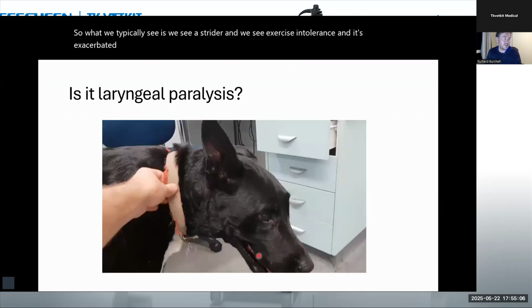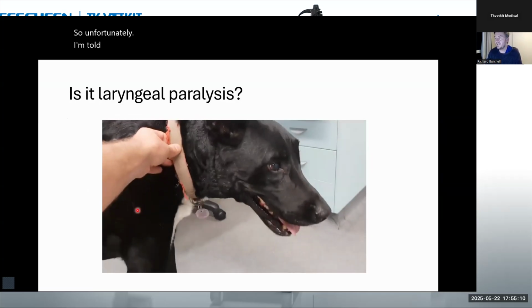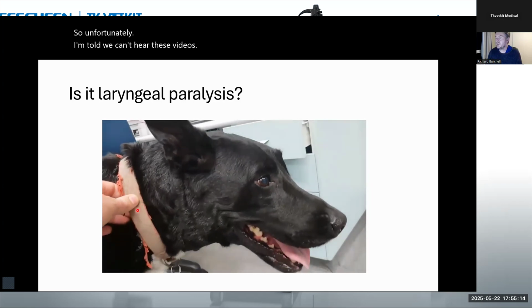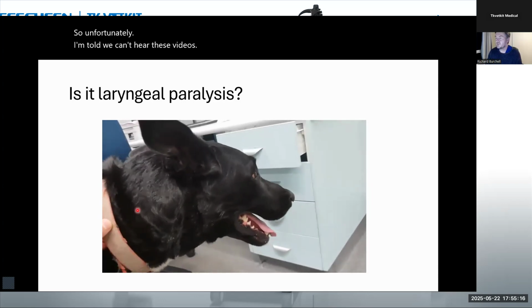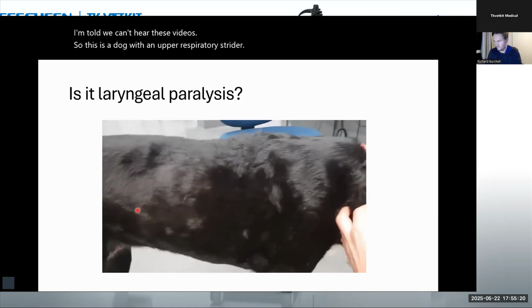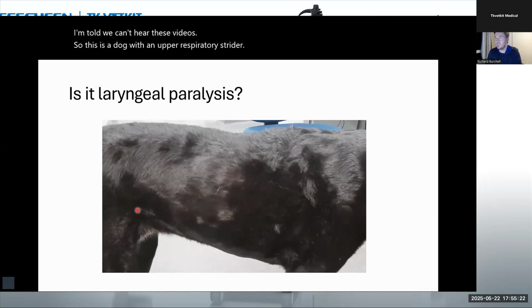Unfortunately, I'm told we can't hear these videos. So this is a dog with an upper respiratory stridor. We can see there's dyspnea.